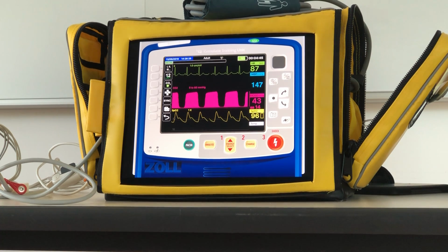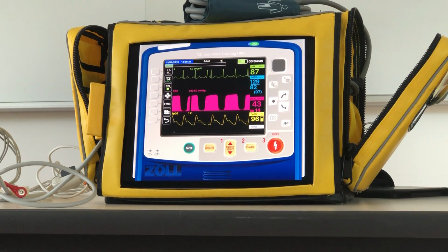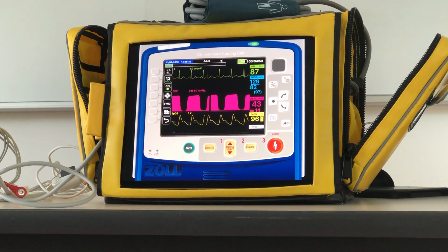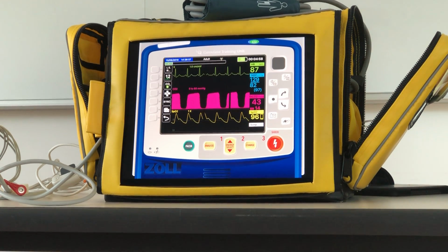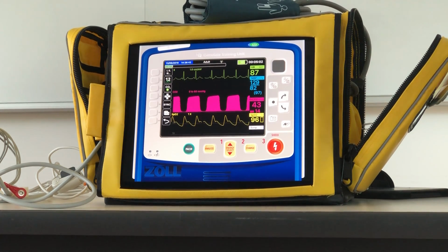They don't just wave a blood pressure cuff over the patient, look at you and say, what's my blood pressure, and get it in 3 seconds. They have to figure out that, oh, I put that on, hit the button, I can go do some other stuff because I got some time. That whole timing sequence and the flow of calls, it's going to happen in the time frame it normally does, and as soon as it's finished, it'll pop up with a vital sign.